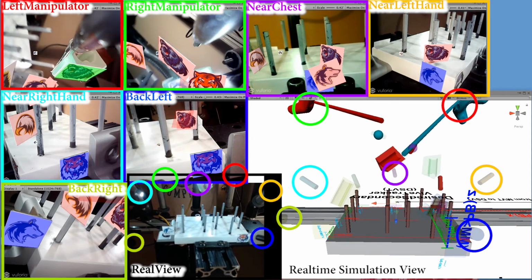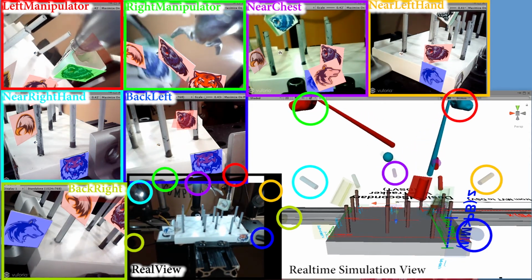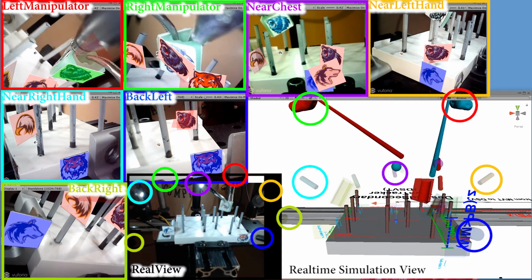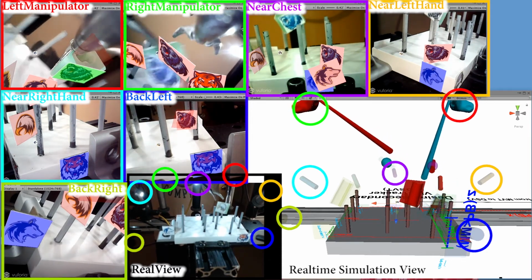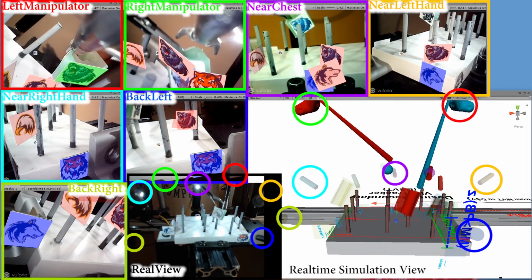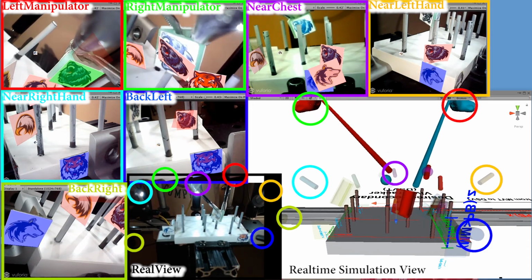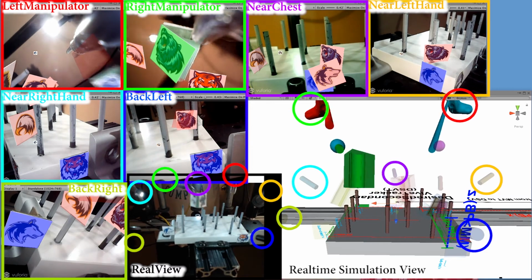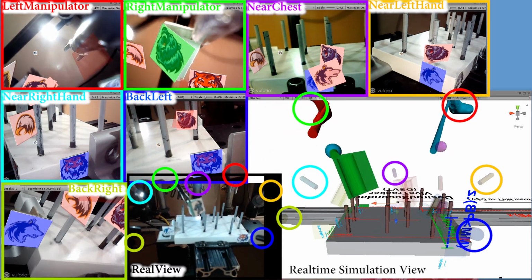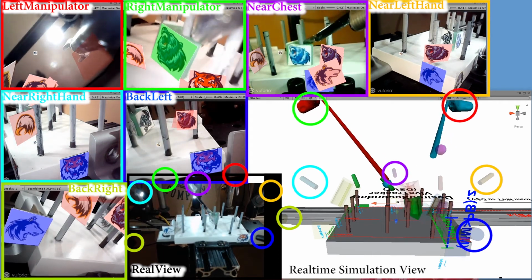I also should have mentioned this first, but within each of the individual camera views, I haven't changed the visualization yet. It still highlights the marker green when it thinks it sees it and it's visible. If it previously had a view of a marker but then it doesn't, it highlights it red. And the static base markers are blue.